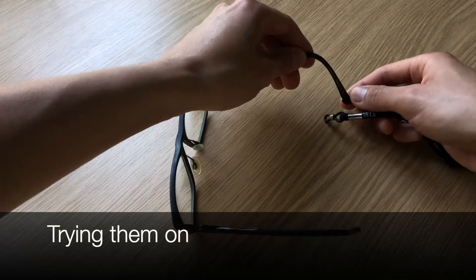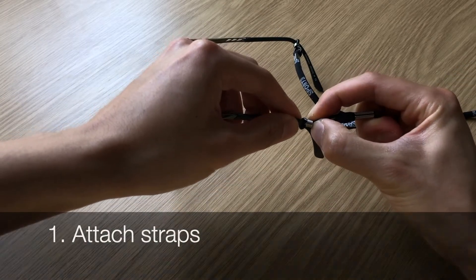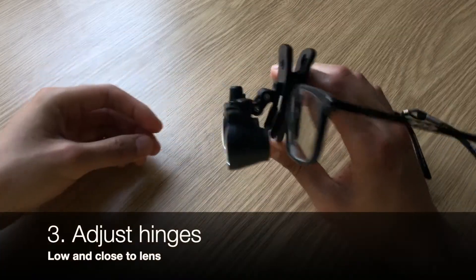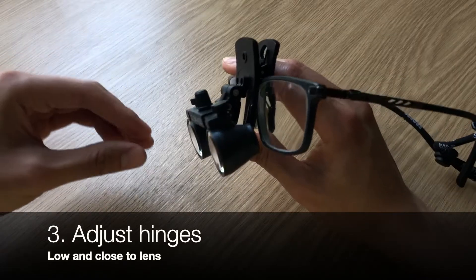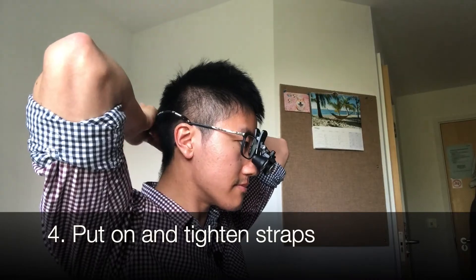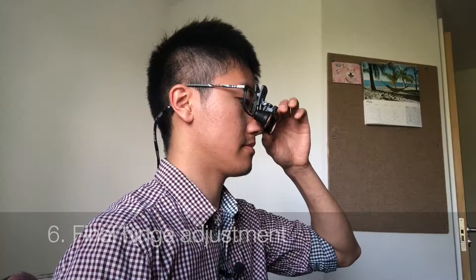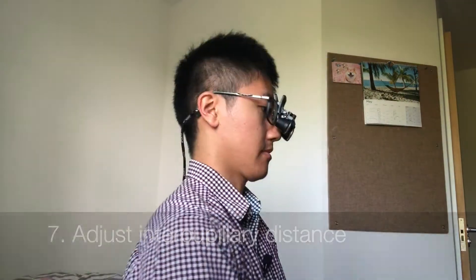So let's try these on. Firstly, I attach the straps and tighten the attachment to my glasses. Then I clip on the loops. I then adjust the hinges to a vaguely good position, which is usually low in the lens and as close to the lens as I can make it. I then put them on my head and tighten the straps. I adjust the height of each lens so that one eye is level with the other, then adjust the hinges again to keep them low in the lens and close to the lens. This does help with your neck position, so you're not craning too much for the whole operation.